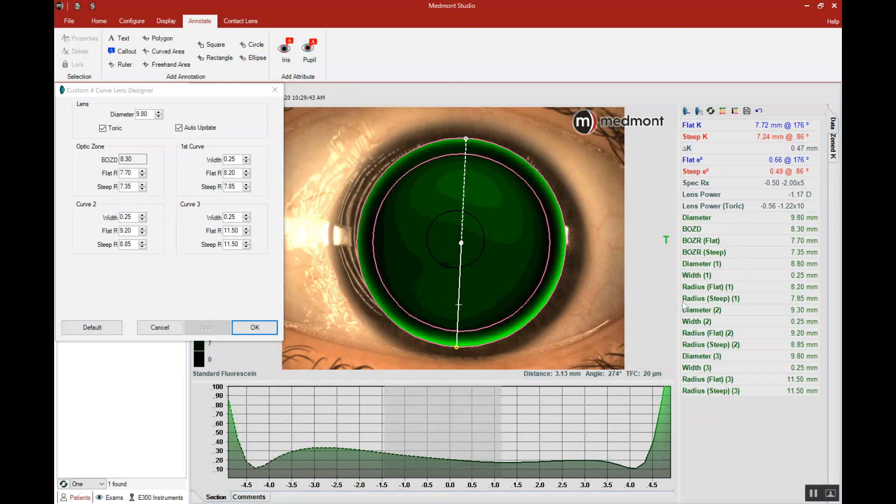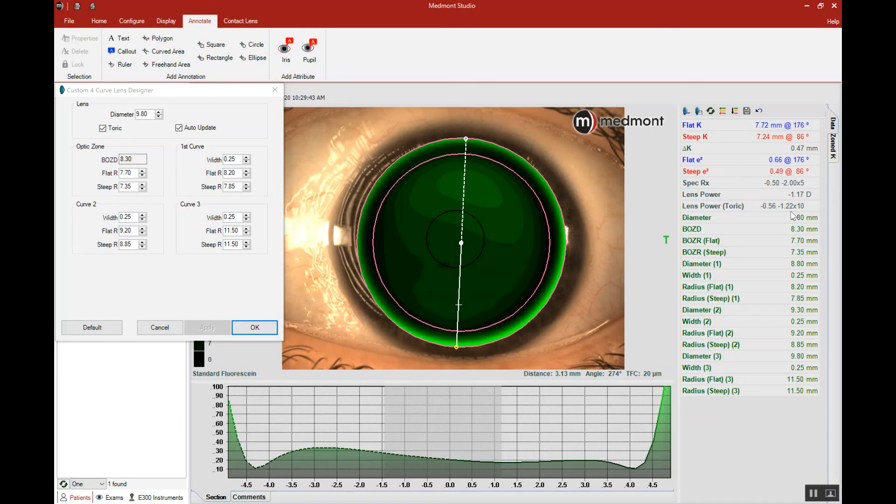And then finally, we have all of the parameters we need for the custom lens on this side. So we can export this map to the lab and they can record this information to design the lens, or we can just provide this information in an email or phone call to our lab.